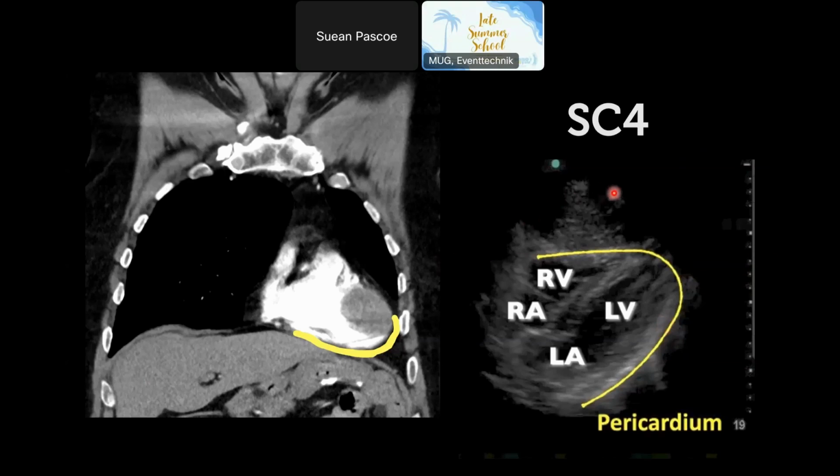In this image here, we've got liver in the foreground, right ventricle, left atrium. We're looking for the free fluid collecting, particularly between the liver and the right ventricle. That's the most gravity dependent portion. And it kind of is counterintuitive here because you're looking from underneath. The gravity dependent portion is actually further away from the probe. And so when we're looking from underneath, it's not further away, I should say, I'm confusing myself here. When we look from underneath, as we come up here, we've got liver, and then the gravity dependent portion is here. So that's where the fluid collects.